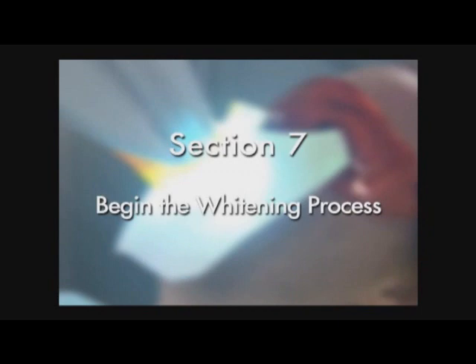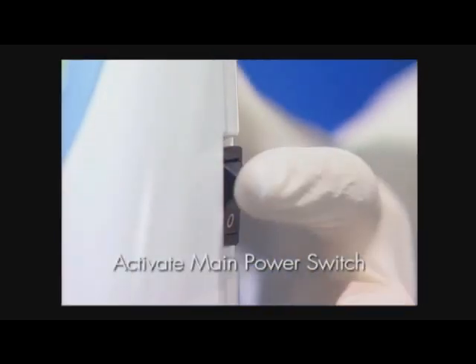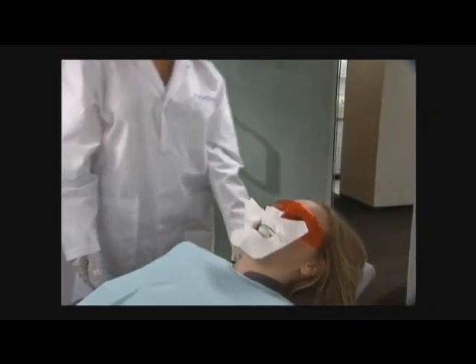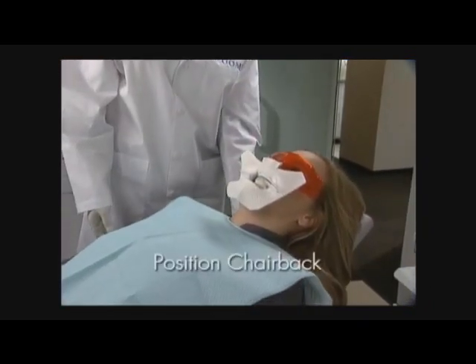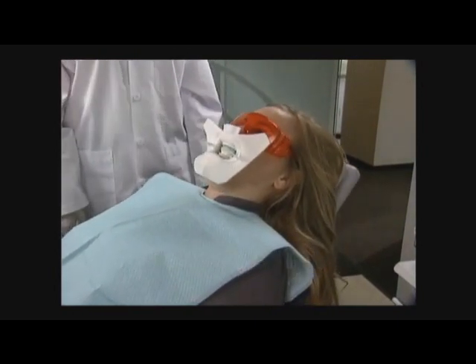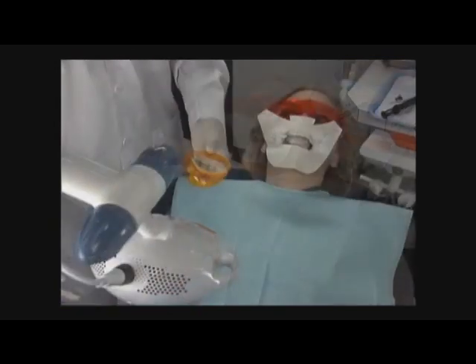Section 7. Begin the whitening process. Activate the main power switch located on the side of the power supply module. The dash side of the button should be pressed for the unit to be in the on position. Adjust the back of the chair to a comfortable position, approximately reclined 30 degrees. This is the easiest position for lamp placement, but adjust appropriately for patient comfort.